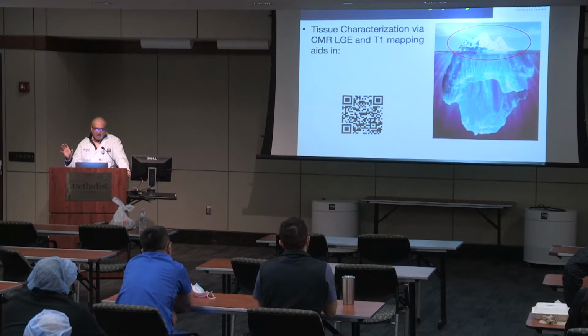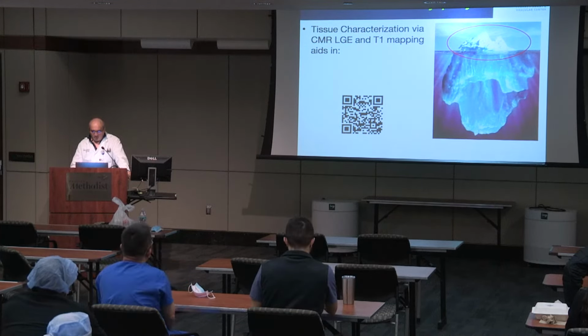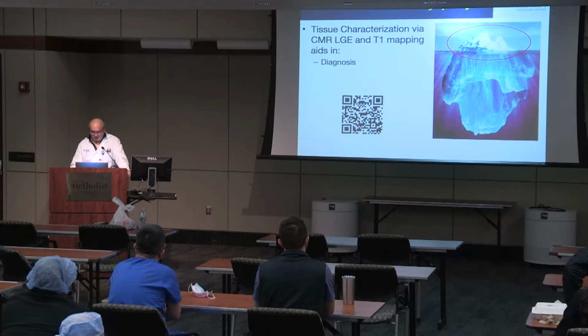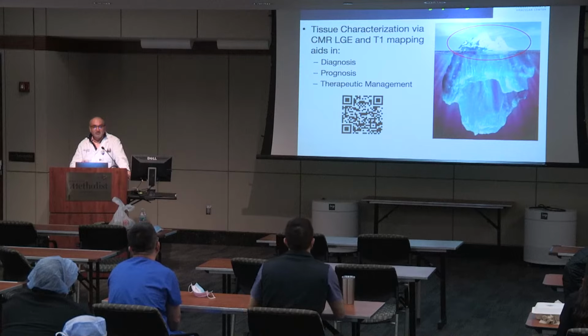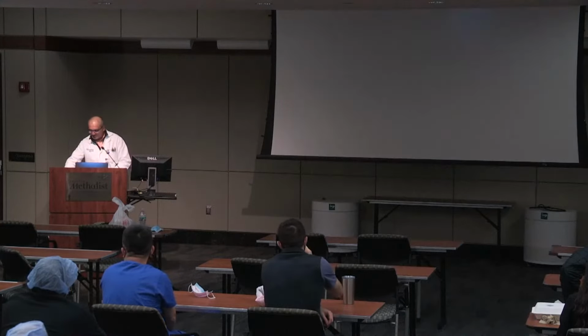And lastly, I think the real strength of MRI, as we talked about, is this tissue characterization, the ability to look directly into the myocardium, which really helps you with diagnosis as well as prognosis, and hopefully will ultimately help us in the future with therapeutic management of our patients. So with that, I want to thank you for your attention. I'm going to turn it over to Dr. Al-Mallah, who's going to talk to us about the role of nuclear.